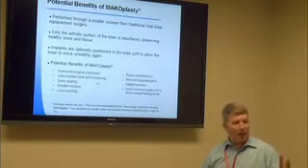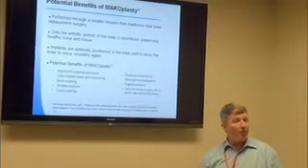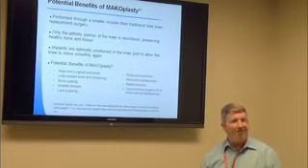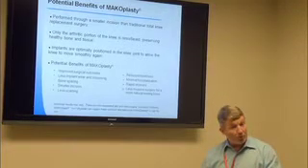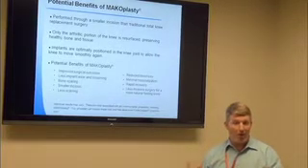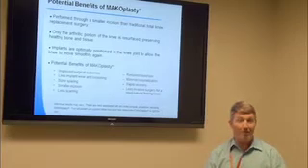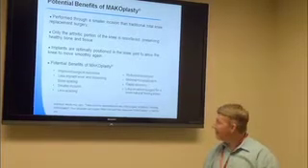Like I was telling you guys, with a total knee replacement, it is oftentimes up to about a year before my patients will come in and say, you know, doc, finally, this knee finally feels like it's my own now. Whereas these partials that we do with the robot system, it's a lot sooner. You're talking about on the order of a few months. They're like, doc, this thing feels just like new. That's a major difference that we've seen there.